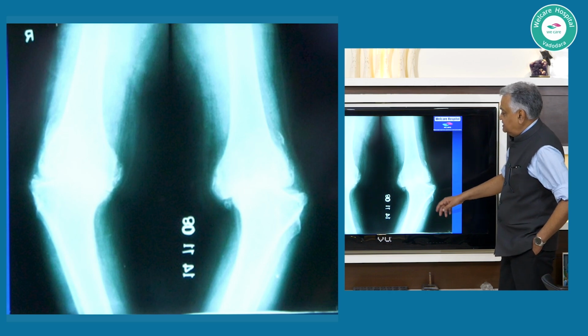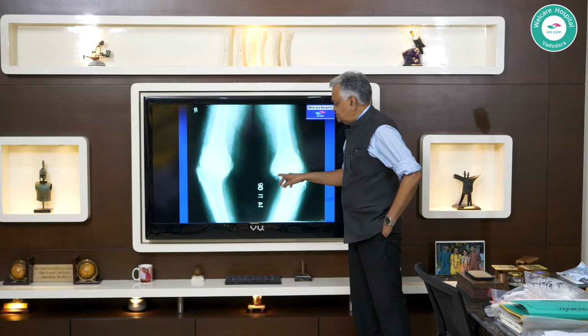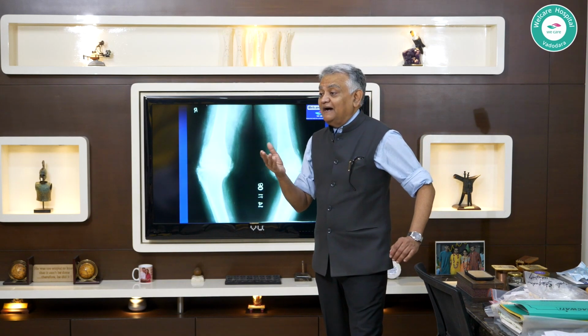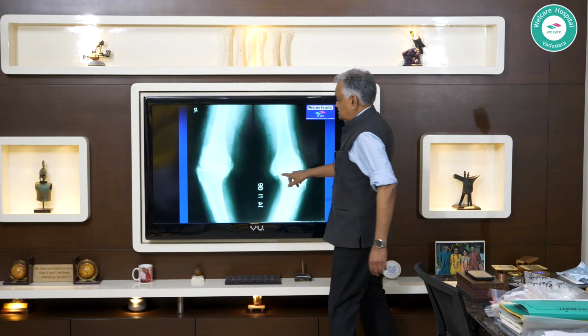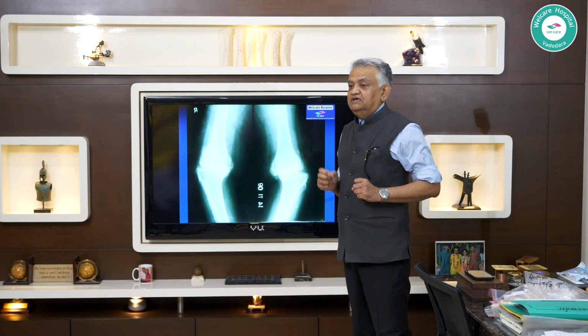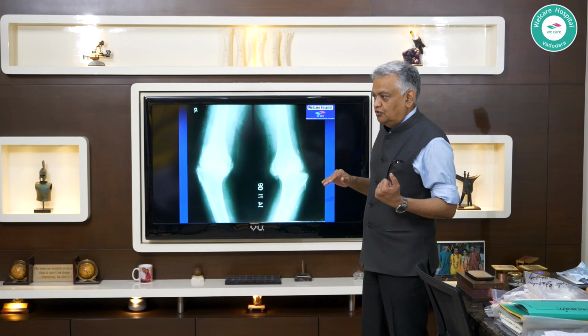And then I think someone mentioned the bone loss, or they will see a cavity. No, it's not might be, you will 100% see it, and how much bone loss is present is also a very important part of preemptive understanding of what you will see on the table and what you are likely to then do on the table.